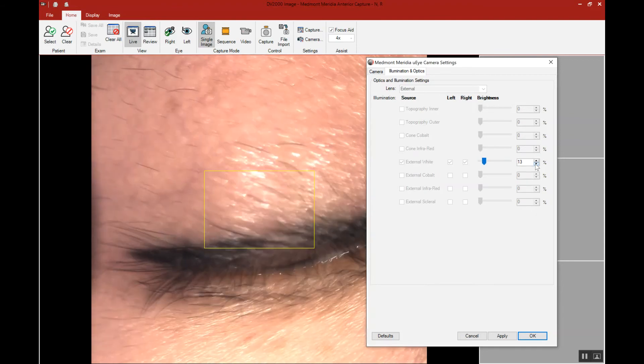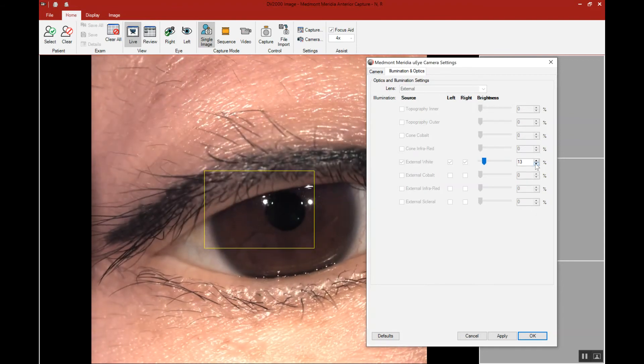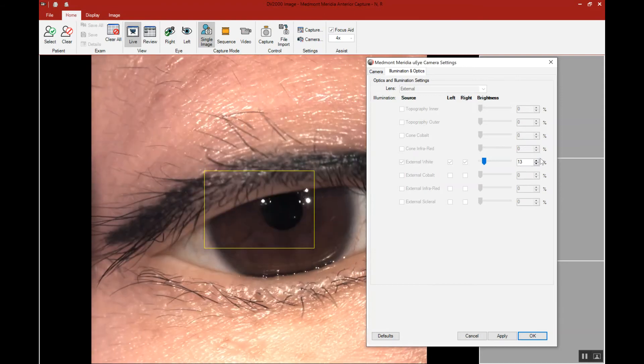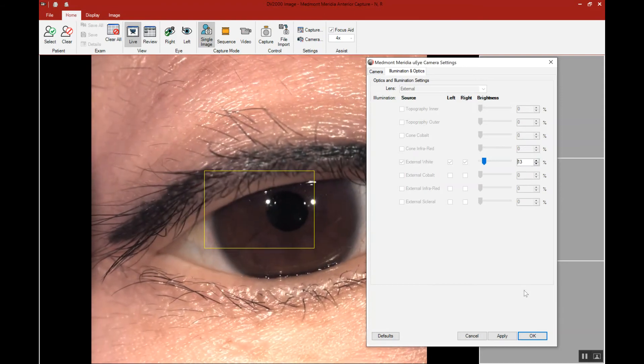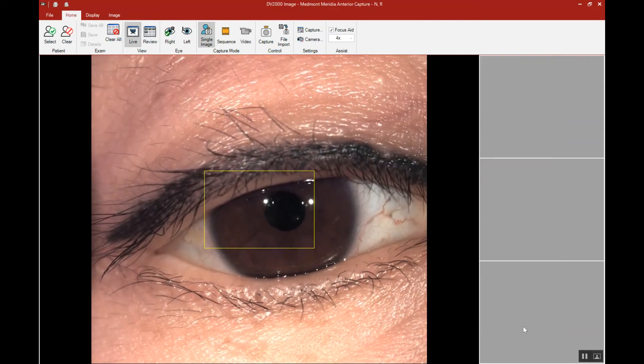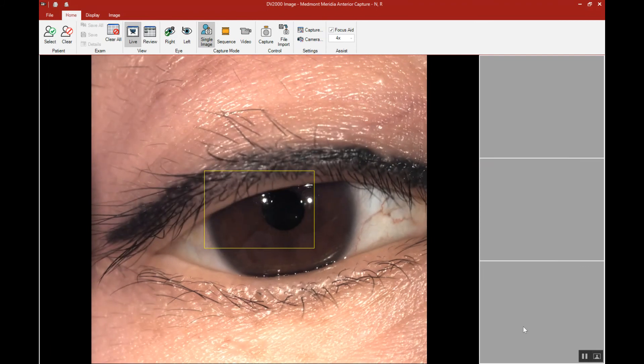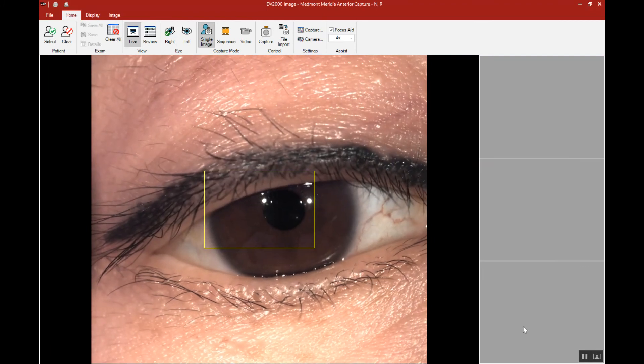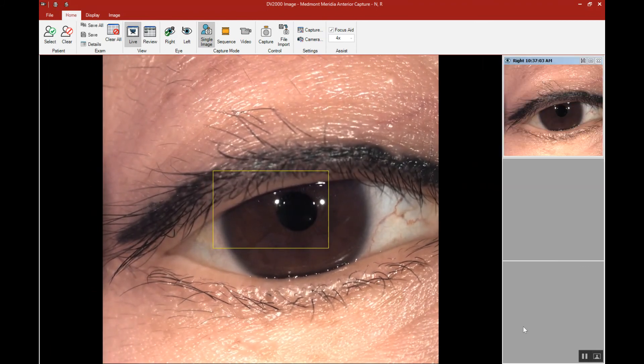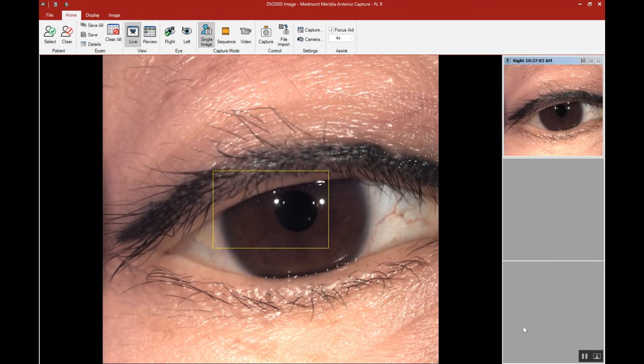In this case, I think we're happy with the illumination at this point. We can say OK, and then we're ready to begin focusing and capturing our ideal image.